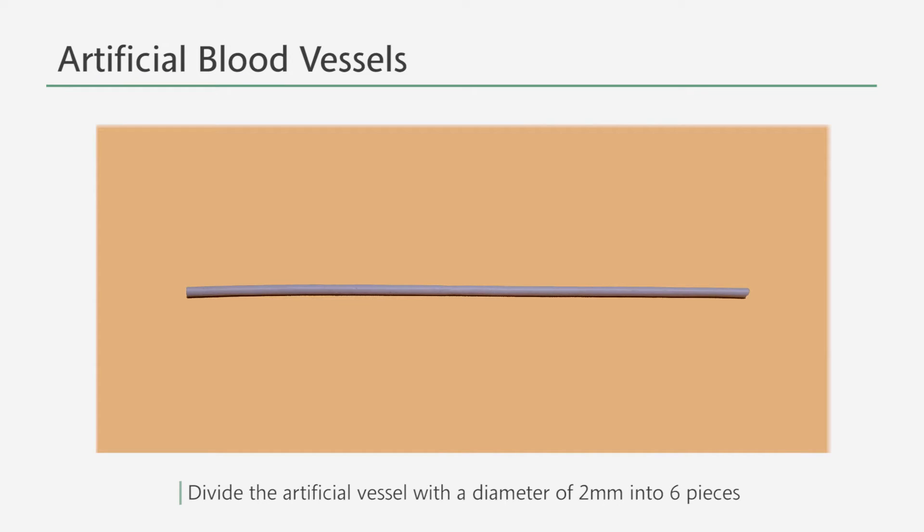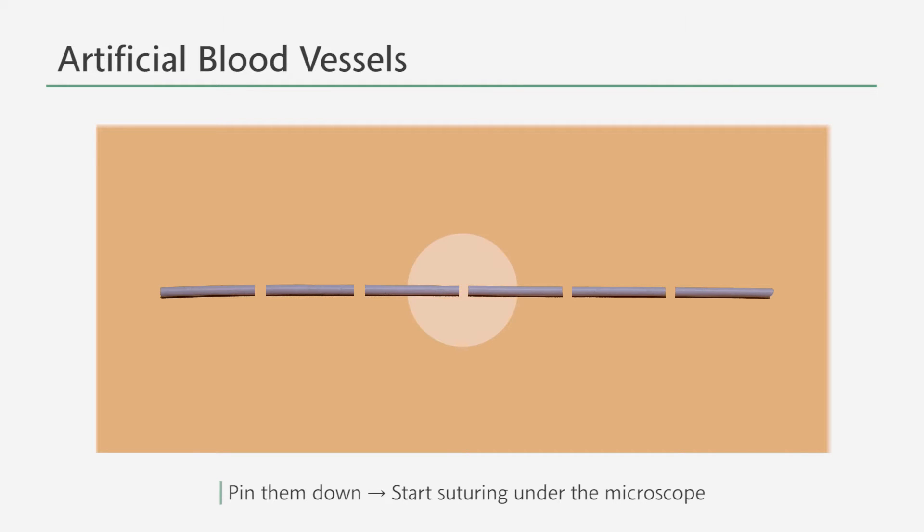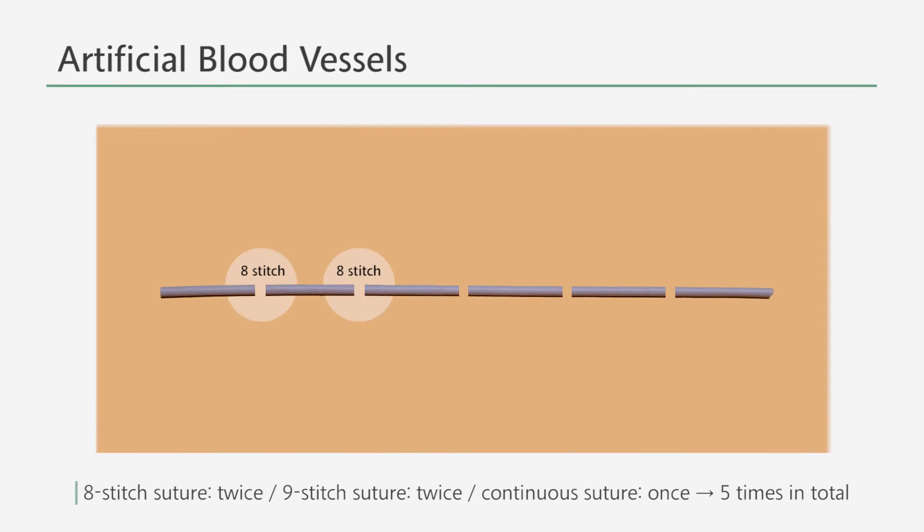In the second training with artificial vessels, you're provided with an artificial vessel of two millimeters in diameter. You're meant to divide it into six pieces, pin down each end, and suture them under the microscope. You must perform eight stitches of a simple suture twice, nine stitches of a simple suture twice, and continuous suture once. Hence, in total you will practice suturing five times.